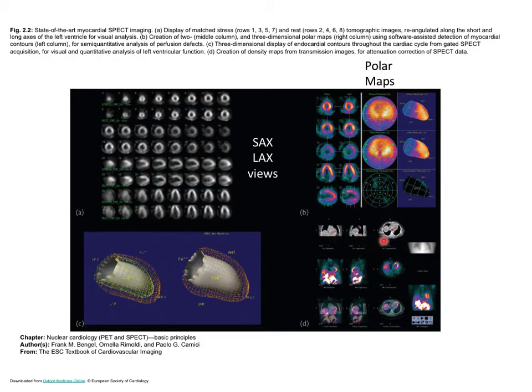Oftentimes there is a CT that accompanies this data, and the reason is to compensate for estimating the attenuation of the gamma rays as they exit the patient in different directions. To do that, a CT is very useful.